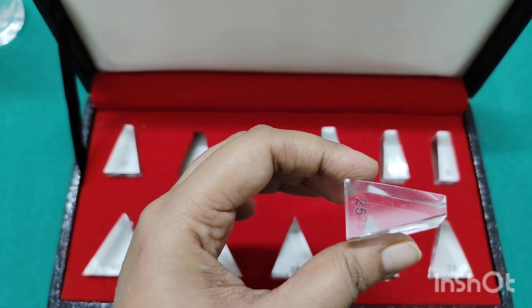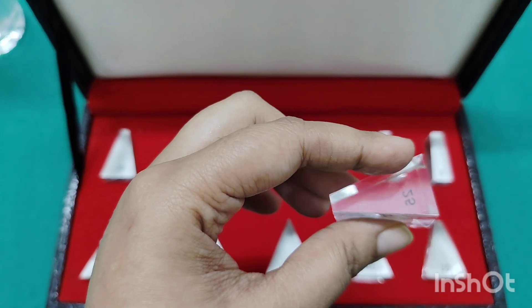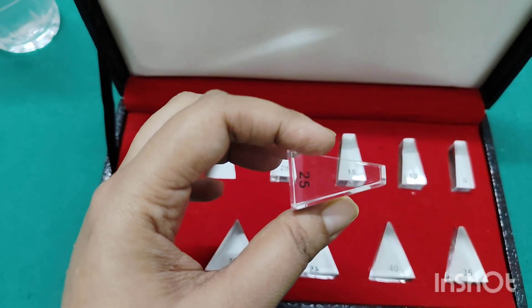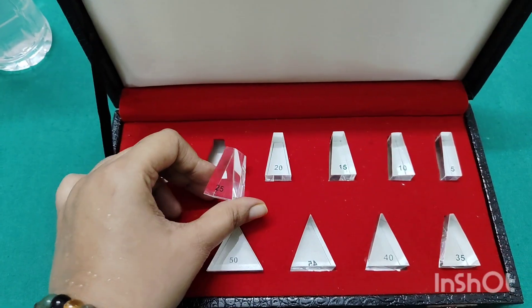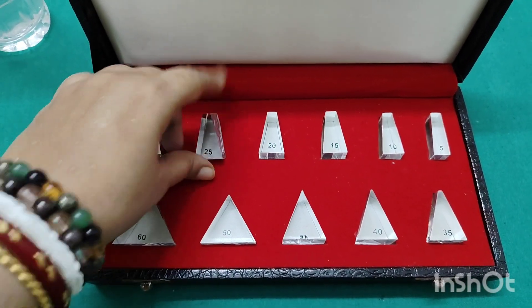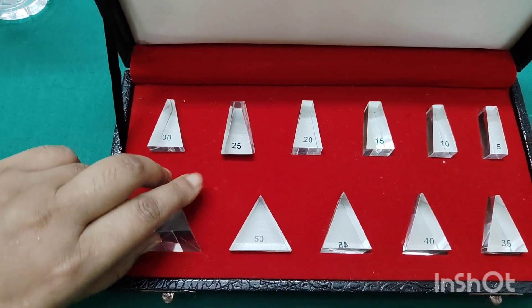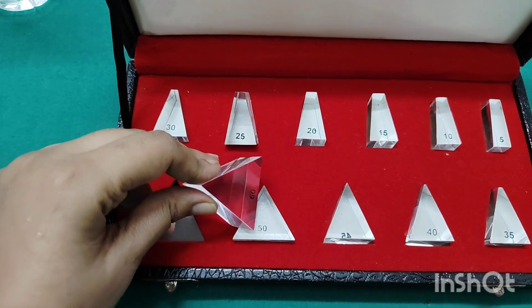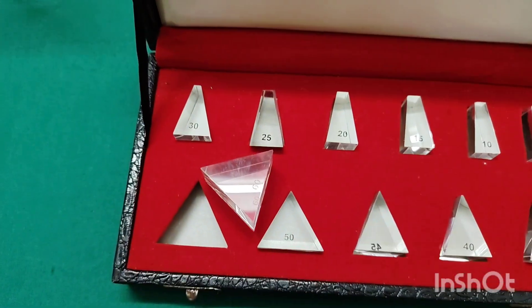Start with the 5 prism. If there is still movement of exotropia, increase to 10 prism, then 15 prism, and so on, until you get ortho. These loose prism sets are used to measure large amounts of squint — from 5 to 60 prism — so perform squint evaluation before squint surgery.